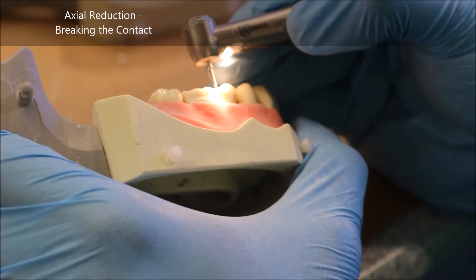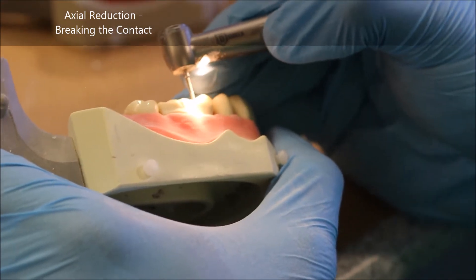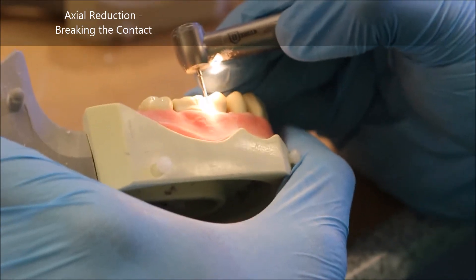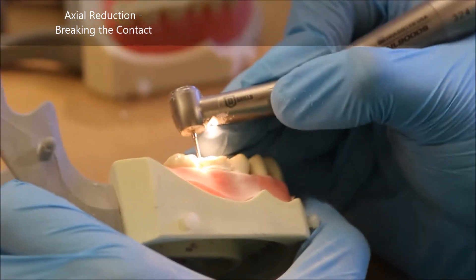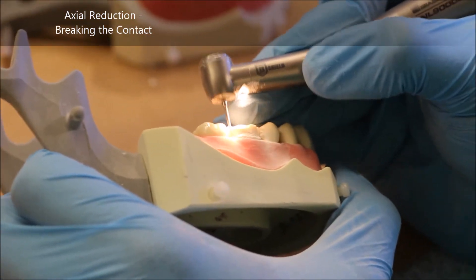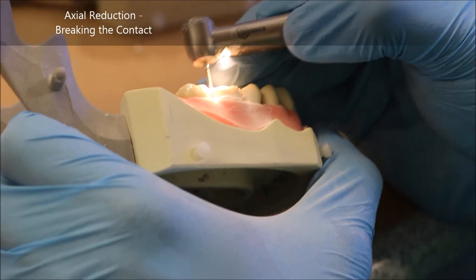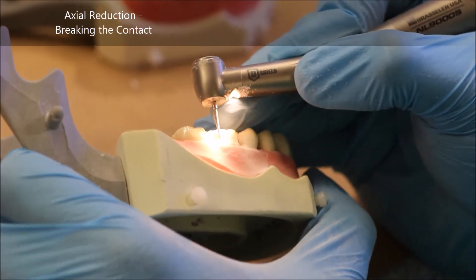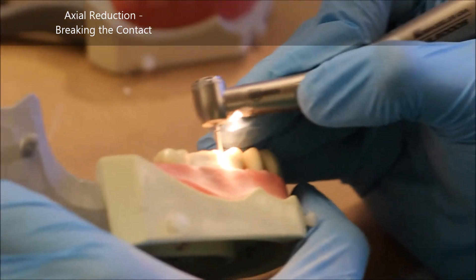With the 850, you basically place it where you left off making your chamfer on the buccal portion of the tooth and start drilling through the interproximal. When drilling through the interproximal, it's very important to keep your angulation such that it doesn't nick the adjacent tooth. The easiest way is to lean ever so slightly towards the tooth, leaving a thin shell of enamel — or ivorine in this case — to prevent your burr from touching the adjacent tooth.